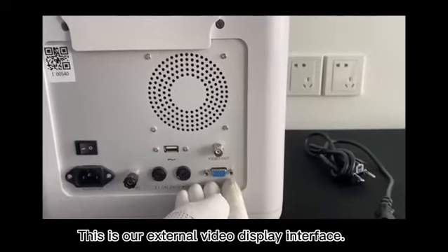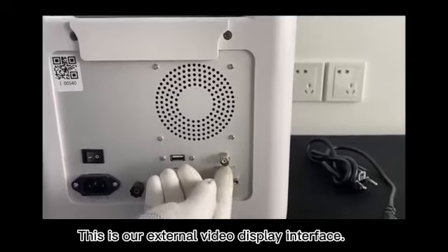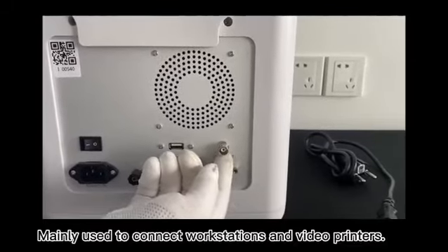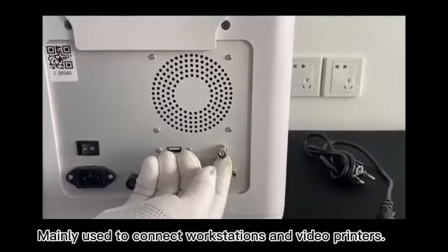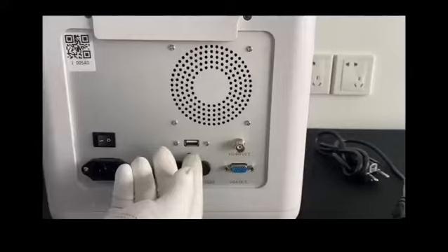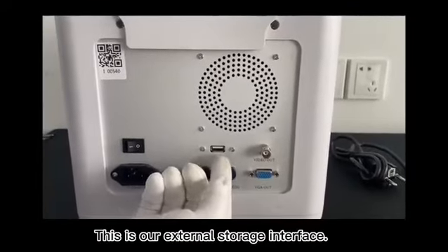This is our external video display interface, mainly used to connect workstations and video printers. This is our external storage interface.